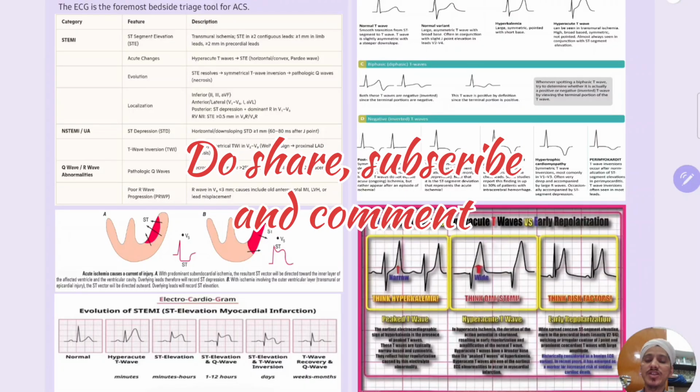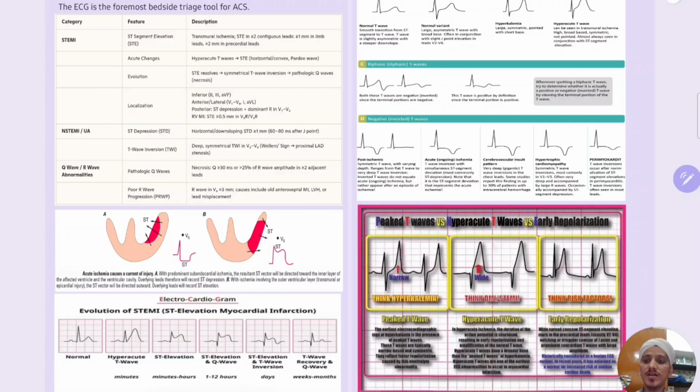So, in the previous video, we were discussing the topic of acute coronary syndromes and ischemia. We discussed STEMI, what is STEMI, and how much ST elevation is required. What will be the evolution of STEMI, localization of the infarction part, and NSTEMI. What are the criteria of ST depression and STEMI, T-wave inversions?